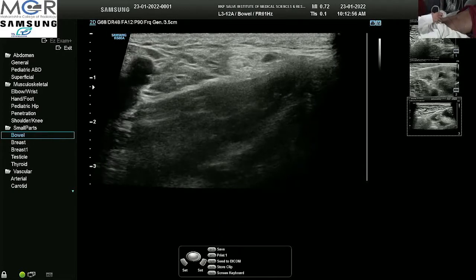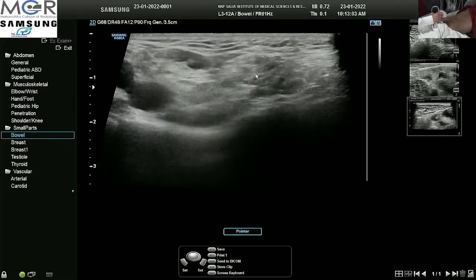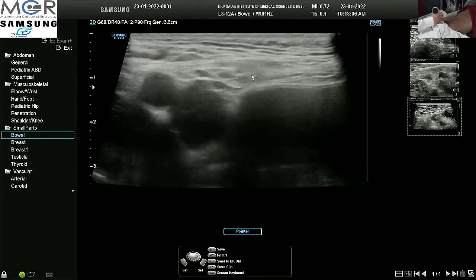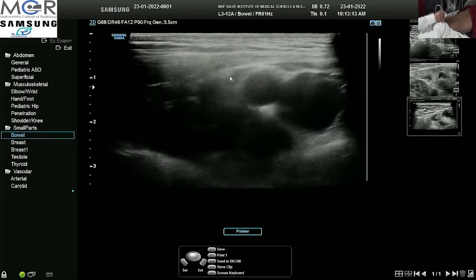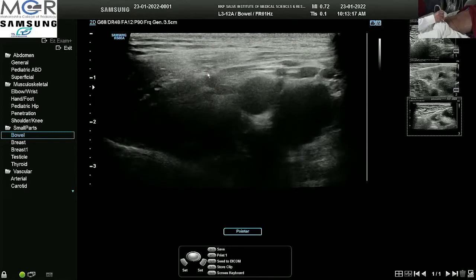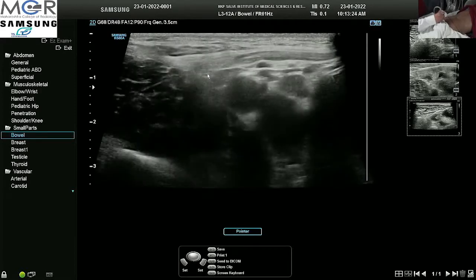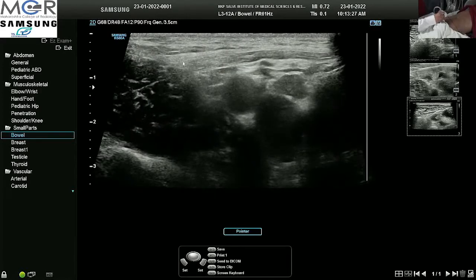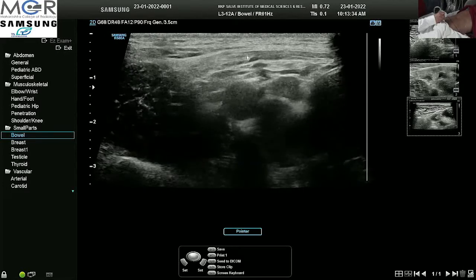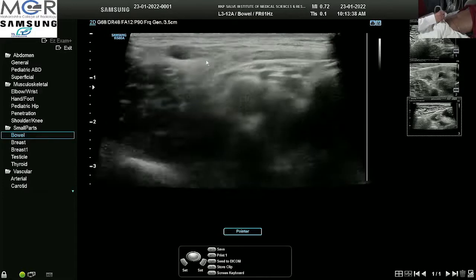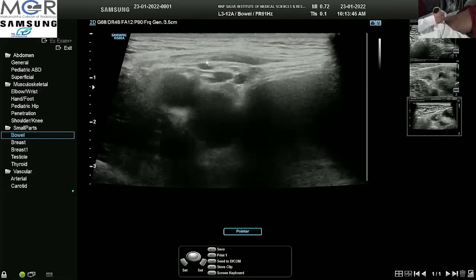Here I am seeing the spermatic cord and I am trying to trace it within the abdomen. As I come within the abdomen, I see the deep inguinal ring. I ask him to cough — in case of hernia, there is a positive cough reflex where there is herniation of omentum, mesenteric fat, and bowel loop into the deep inguinal ring. The aponeuroses are deficient at the deep inguinal ring and the superficial inguinal ring, and these can lead to inguinal hernias, as we all know.